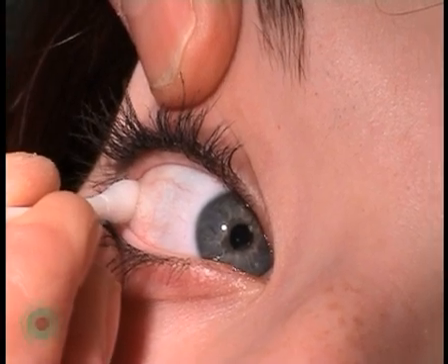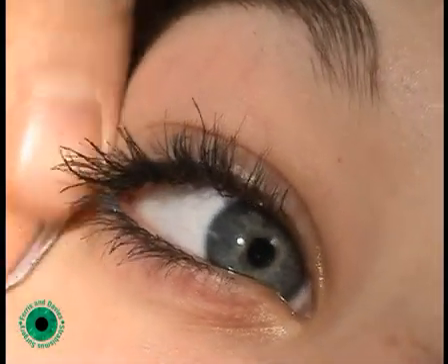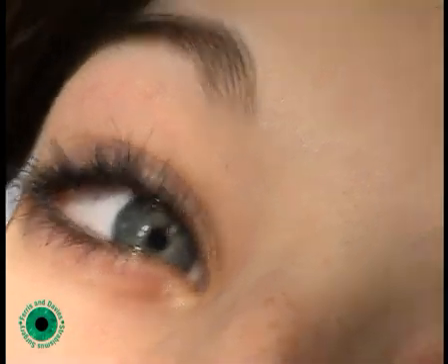Once the eye has been numbed with the amethocaine drops, and then a cotton wool bud soaked in the amethocaine, an electrode is placed by the lateral rectus, and a reference electrode placed in the middle of the forehead, as shown.